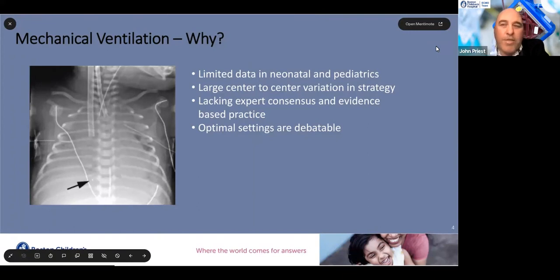So in this situation, it's very important to determine what you're going to use for rest settings, because this could really affect the back end of ECMO when you're starting to wean and starting to come off ECMO, and can really determine the extent of lung injury that your choices provide.